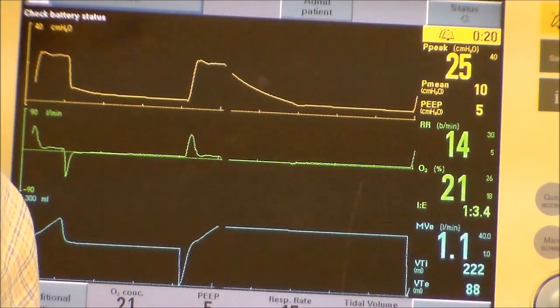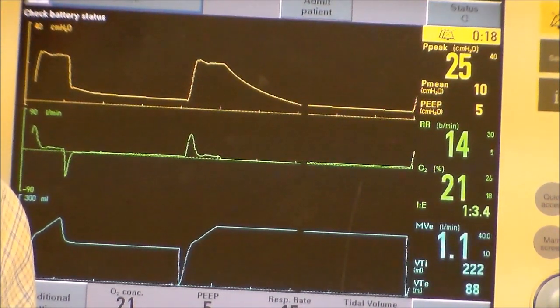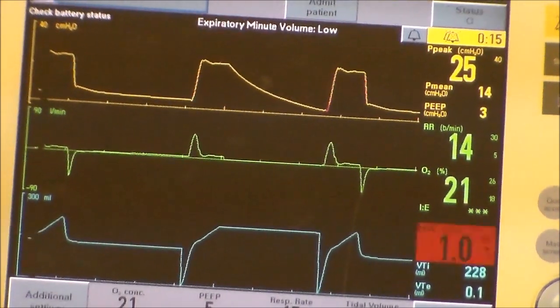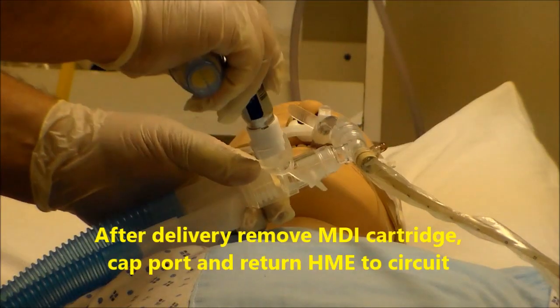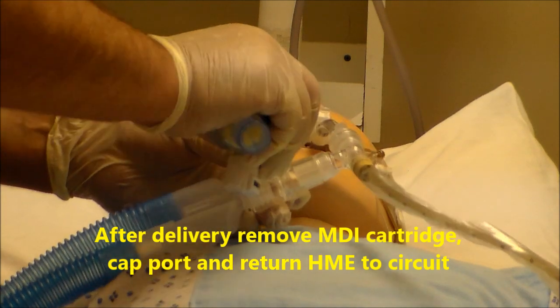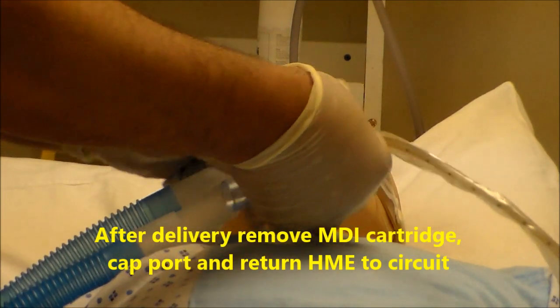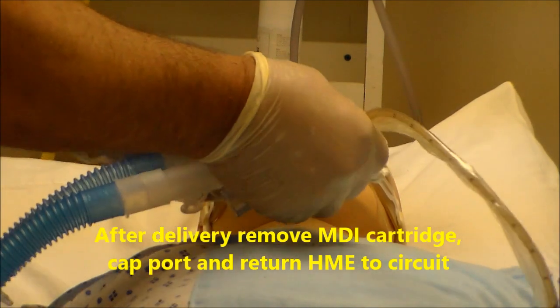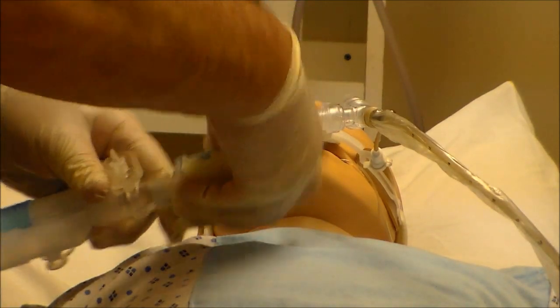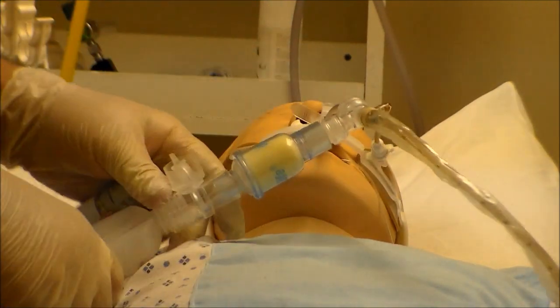When you do an MDI, make sure you time it with inspiration and do an inspiratory hold. After giving the puffs, take out the MDI, recap it, and then place the HME back in line with the circuit.